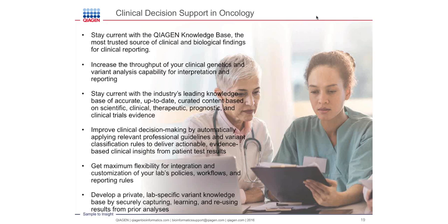Oh, that's a great question. The predominant majority of the time spent by variant scientists is on literature curation and variant interpretation. In an internal study we did at QIAGEN, we have shown that QCI Interpret reduces the test interpretation time by almost 75%. So that time that is saved can be used for secondary review, QA and compliance, and also scalability.